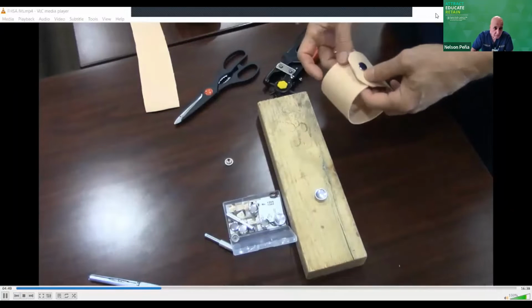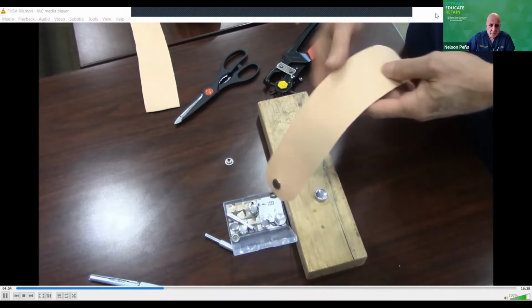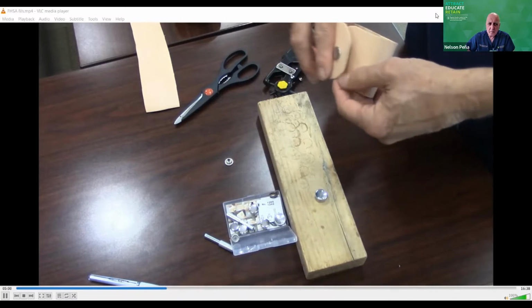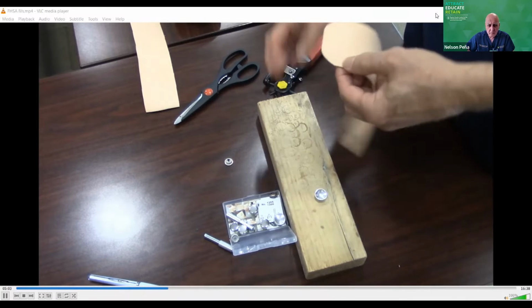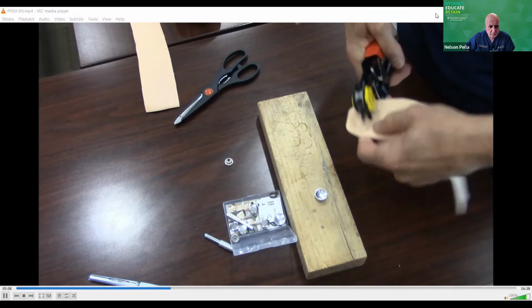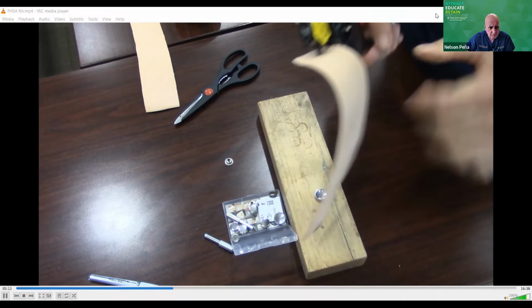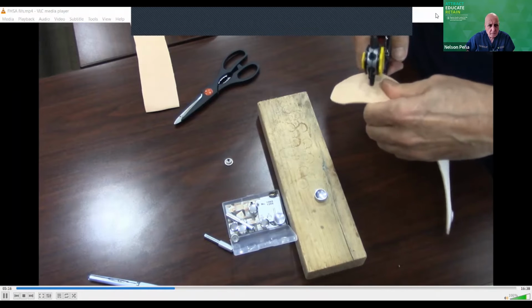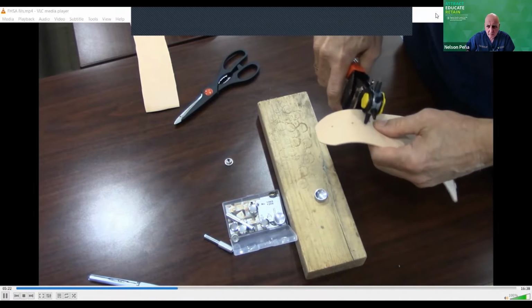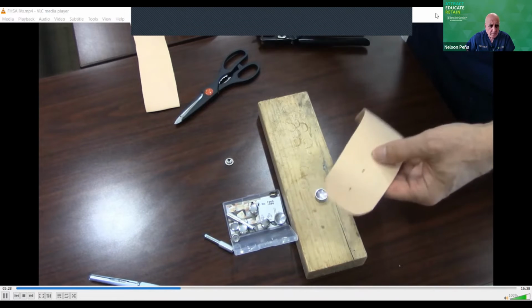Now for the other ones, I'm going to punch some more holes in it just to give myself a little variability. That way if I'm using a pediatric simulator or something, I don't want to snap it as hard, so I'm going to give myself a little adjustment. So I'll put a couple more holes in here. Put another one here at the end. And another one a little farther up, maybe an inch over. And just for good measure, I think I'm going to add a third one. Okay, so now I've got all the holes put in.